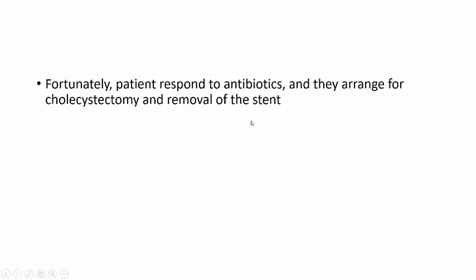So, as you see, point of care ultrasound goes with you step by step in all the stages of management of our patient, starting from the diagnosis of the gallbladder stone and biliary colic, and going to the first complication, which is acute dilatation of the common bile duct by stone inside the common bile duct, and we follow up the stenting and successful stenting and the clearance of the common bile duct and the intrahepatic biliary dilatation, and lastly we diagnose infection and the florid inflammation very clearly by ultrasound, and in each step we take a different management.